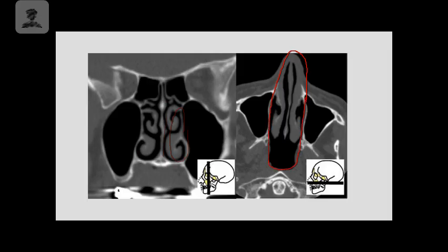Coming backwards, I believe this is going to be our ethmoid sinuses, pretty low there. And then we're going to be able to see our maxillary sinuses on each side as well. So again, like I mentioned, they should be black because there's nothing inside of them until we get fluid involved. And then we will start to see some shades of gray within those cavities.